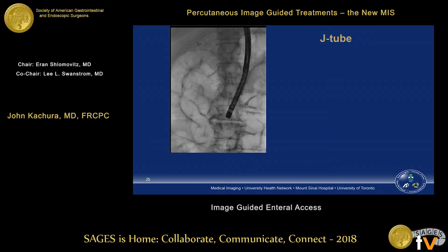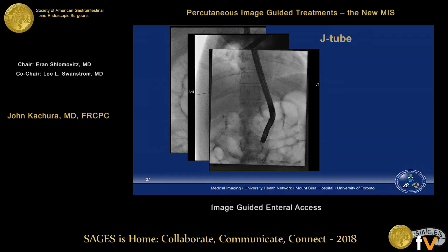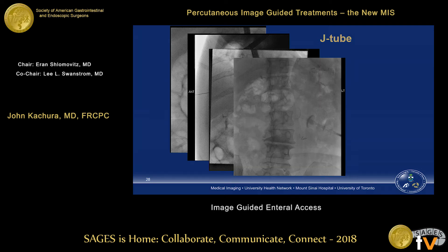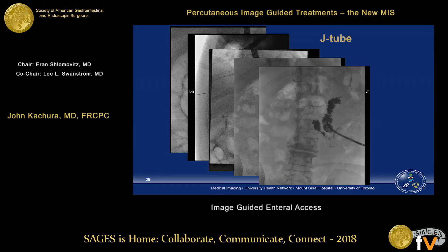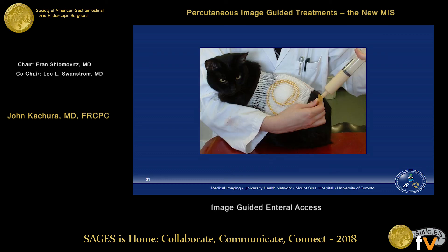Using both endoscopy and fluoroscopy together — as in a case where a J-tube was needed in a patient with what appeared to be an afferent limb obstruction or partial gastrectomy — with the scope in place and lateral fluoroscopy, you can identify a superficially located jejunal loop, puncture trans-abdominally, pass your wire, grasp it, and pull a PEJ tube trans-orally, confirming correct position without contrast extravasation. This shows the benefit of combining endoscopic and image guidance. Perhaps the only remaining frontier for image guidance is gastrostomy tubes for cats, which I think are still in the surgical domain. Thank you very much for your attention.